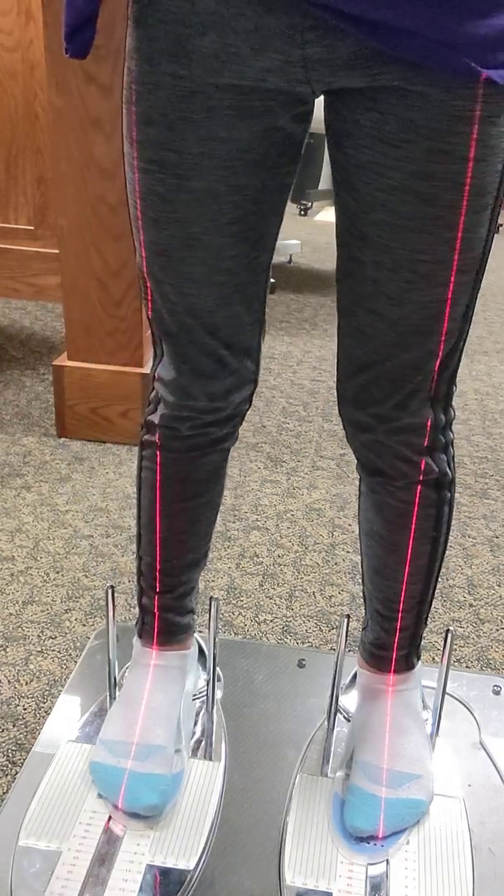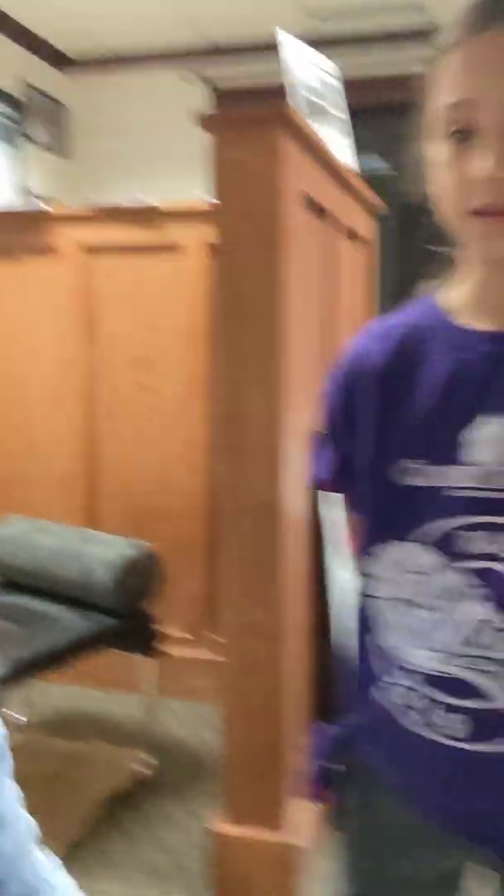So we'll do a break-in phase with this — meaning we'll work on putting these in her shoes for a little bit of time and let a break-in period happen. Don't just put them in your kiddo's or your athlete's shoes and expect them to go play a basketball game. That wouldn't be a smart move, because these muscles have to change a little bit and work on turning on and getting effective again.